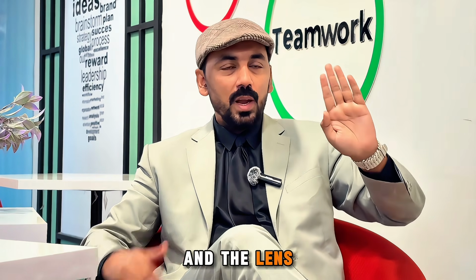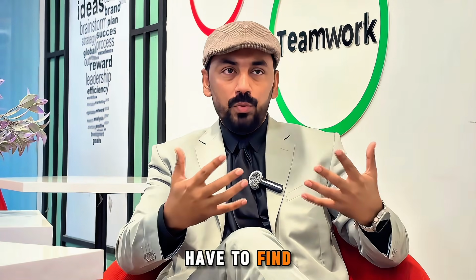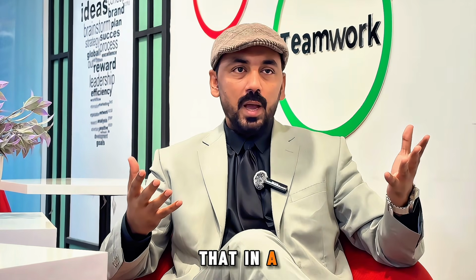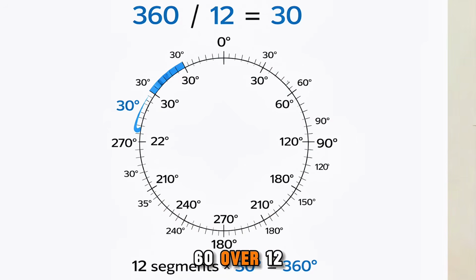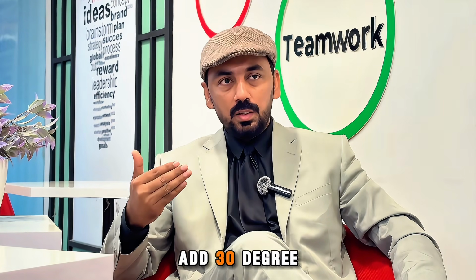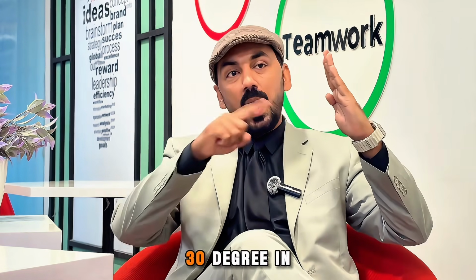So for example, the lens is moving from the 6 o'clock position to the 7 o'clock position, and the lens rotation is of 1 clock hour, from 6 to 7. So we have to find out how many degrees there are in 1 clock hour. For that, we know that in a whole circle there are 360 degrees and 12 clock hours. So we will do 360 over 12. The answer will be 30. So 30 degrees means if the lens rotation is from 6 to 7, or 1 clock hour, we will add 30 degrees, or we will subtract 30 degrees. For example, if the lens rotation is towards the left side, we will add 30 degrees to the axis.